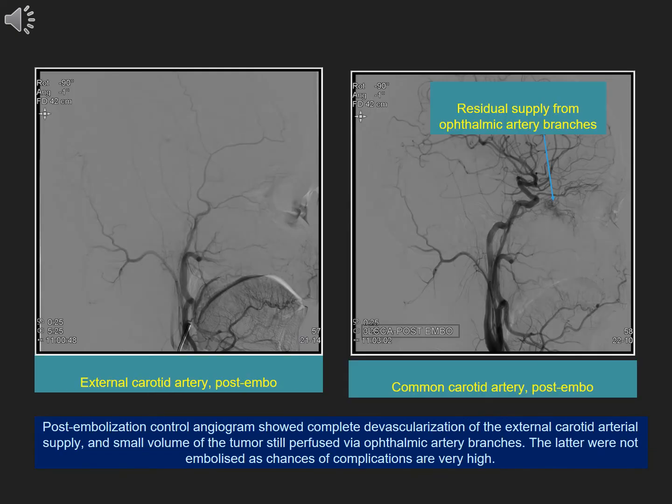Post-embolization control angiogram showed complete devascularization of the external carotid arterial supply, and a small volume of the tumor was still perfused via ophthalmic artery branches. The latter were not embolized, as the chances of complications are very high.